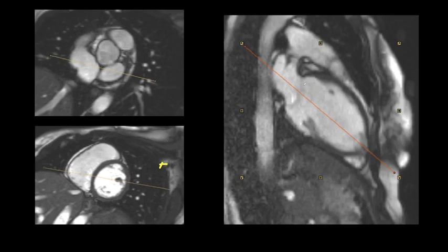So you use your VLA to go through the apex and through the mid of the AV groove. You use the slice at the mid of the ventricle, you go through the lateral wall, septum, and importantly through the RV apex. That's why we need this slice.